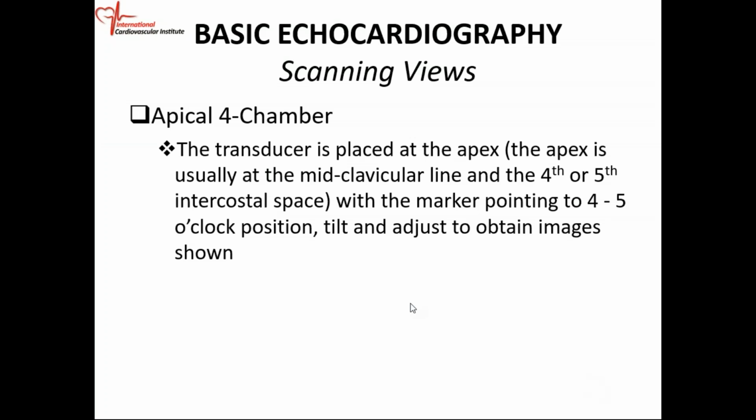So now we're going to look at the apical four-chamber views. To get your apical four-chamber views, you take your transducer up, and remember, when you're going to do your scanning, you have to put a little gel on the tip of the transducer.